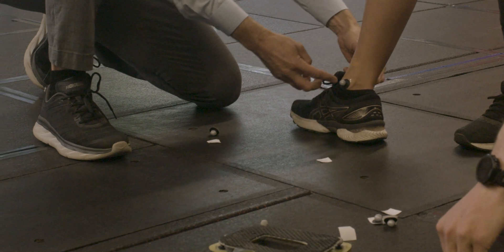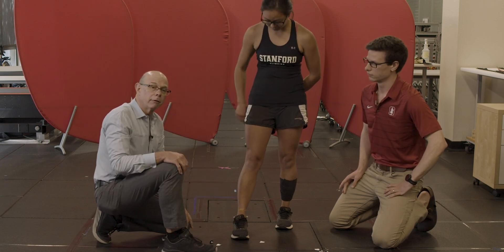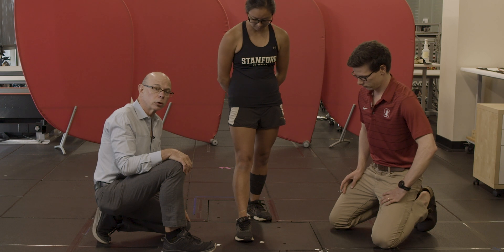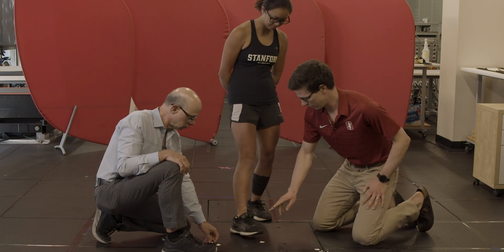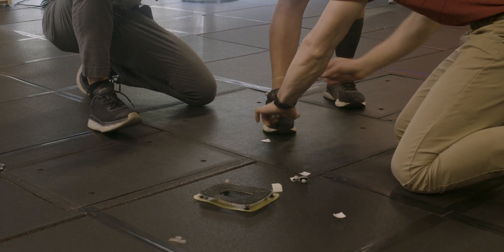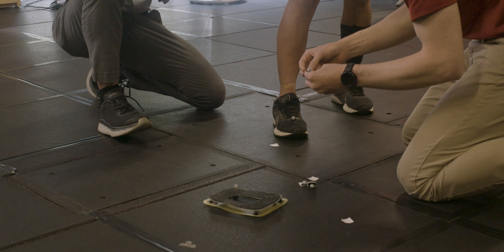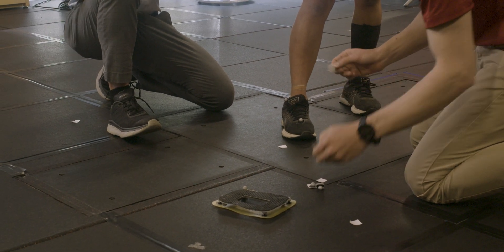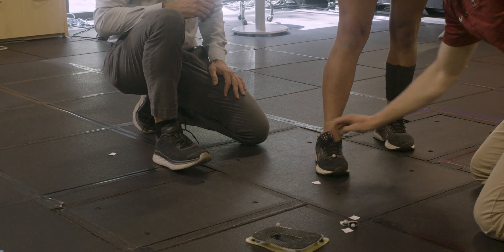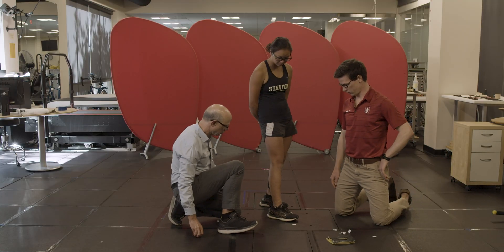Medial malleolus here. These two markers — the medial and lateral malleolus — if you draw a line between them, they define the axis of the ankle quite well. The midpoint between these two markers is what we typically use as the ankle joint center. We also put markers on the foot: on the second metatarsal head where the second toe attaches, on the fifth metatarsal head, and one on the back of the calcaneus. Now we have enough markers to characterize the orientation of the foot in the world.